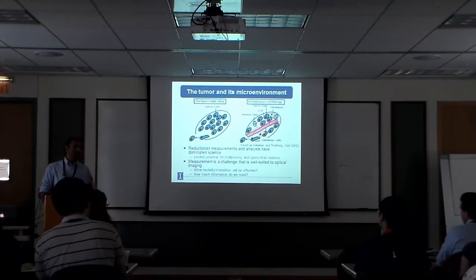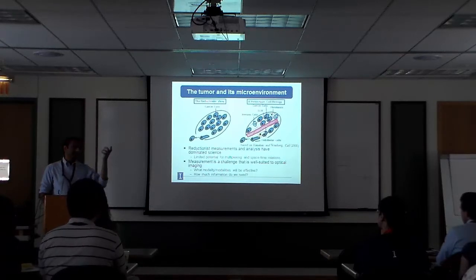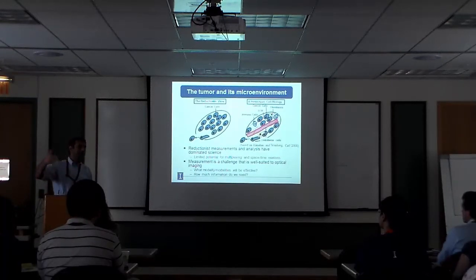You can take immunostains, which we discussed about 40 minutes ago, and we said they weren't very reliable, right? You could stain the tissue, but now you're going to stain it 5 times, 6 times, 10 times, and each one of them is only reliable 80% of the time, right? So 0.8 raised to power 10, quickly somebody do that, it's a very small number. So getting quantitative information from staining repeatedly to analyze the microenvironment is not a good idea. You just cannot do it.